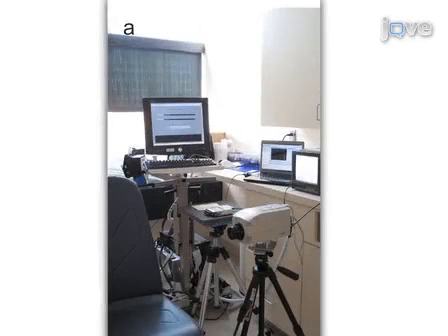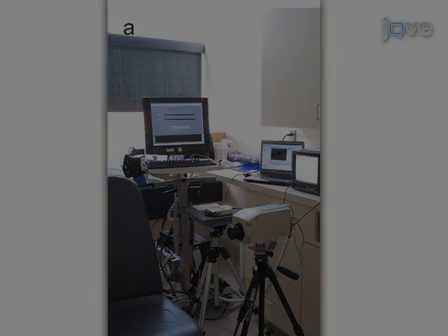Organize a temperature-controlled exam room equipped with an infrared camera and a PC for infrared image acquisition and storage, as well as a data acquisition card connected to a computer.